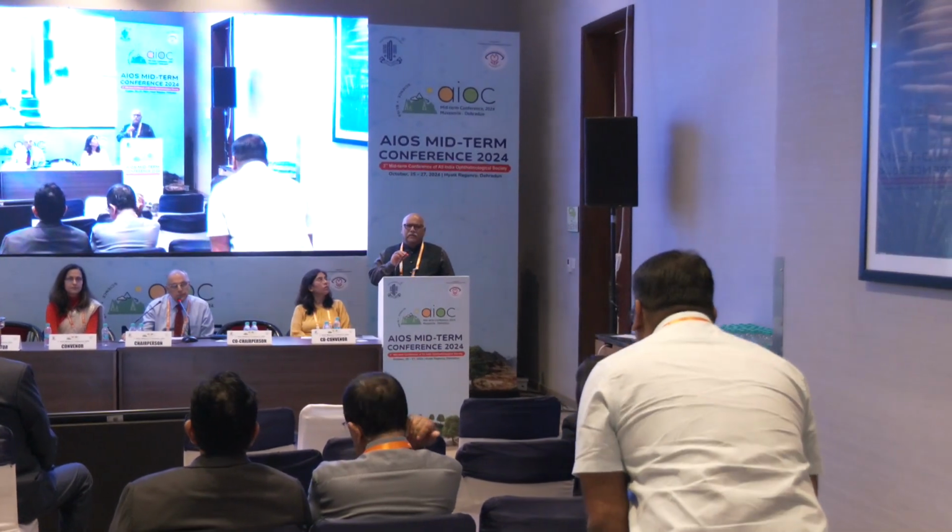I think it's a very valid question. In fact, the first eye also had the same problem; both eyes had symmetrical complications. So I feel that if my primary rexis had been a little larger, it was 2 millimeter, it was quite irregular. The problem with making a larger rexis is that it may run to the periphery. Here it was a very shallow anterior chamber. I had given IV mannitol, so some amount of dehydration of the lens and vitreous had taken place. In spite of that, space was a major constraint there.